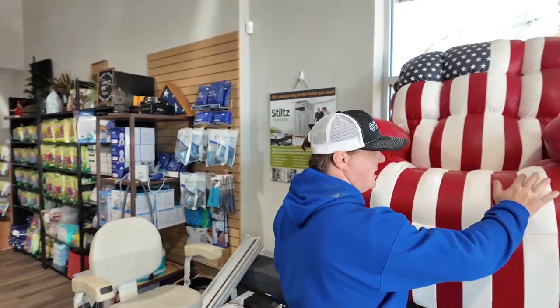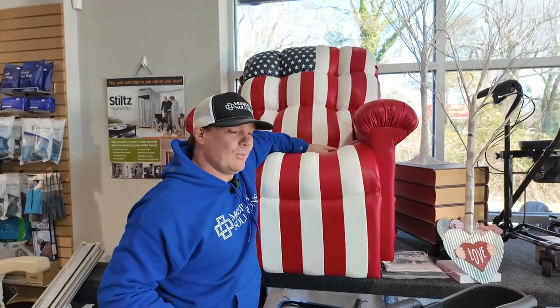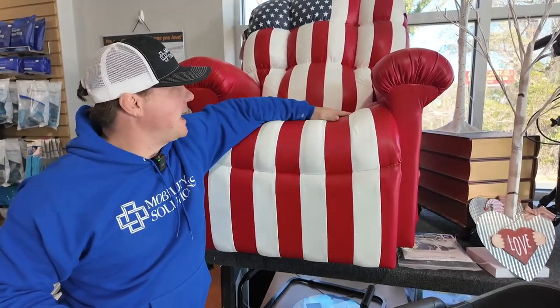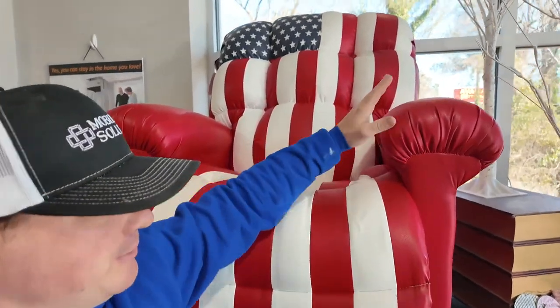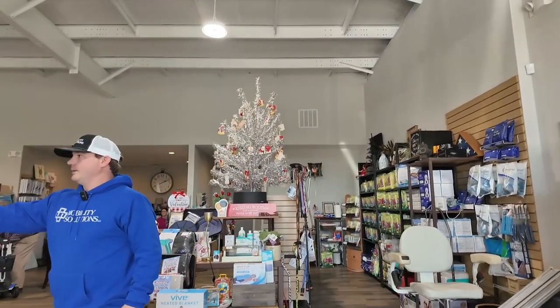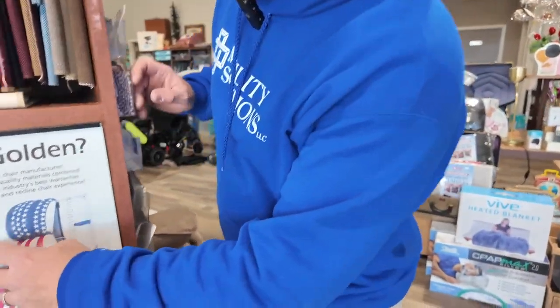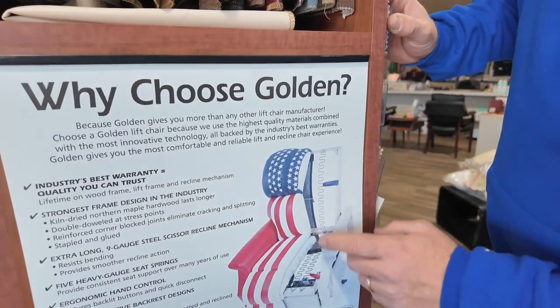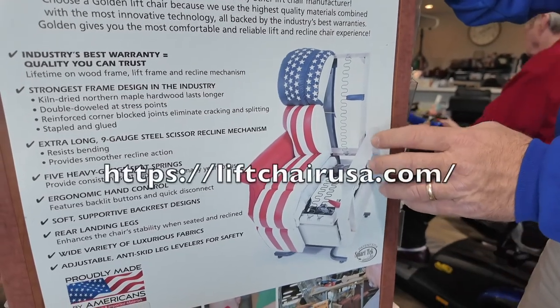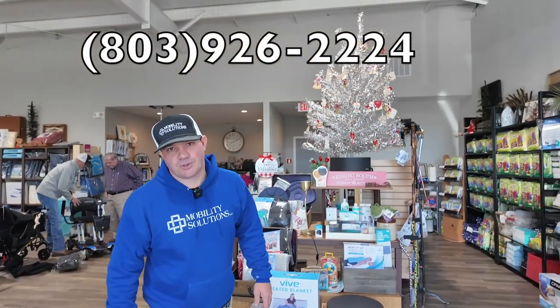Here's a lift chair in a USA pattern — this is my chair, the only one in the world like it. It's a PR514 with the Brisa American-made flag pattern. You're going to love this company because Golden not only has a great warranty but they do special things to make their chairs stand out. Check us out at liftchairusa.com or give us a call at 803-926-2224. Thank you so much.